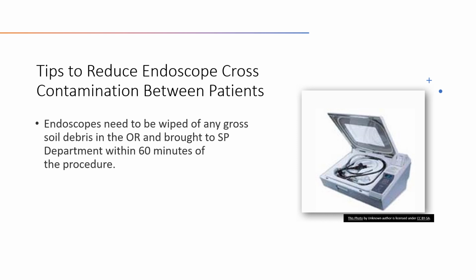The first step in ensuring that an endoscope is properly decontaminated is making sure that in the OR or procedure room, if that's what your facility has, the endoscope is being wiped down throughout the procedure, and also that before being brought to the sterile processing department, the endoscope has any gross soil debris removed, and then also brought to the sterile processing department within 60 minutes of the procedure. Very important, within 60 minutes.